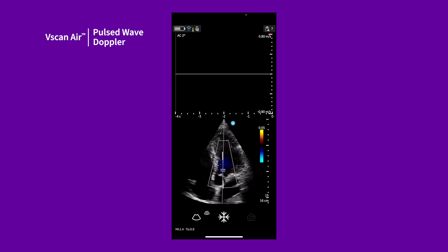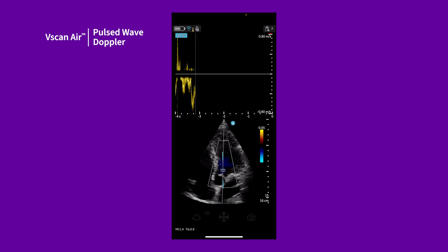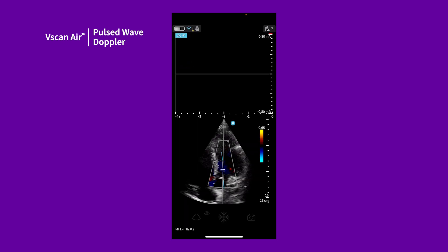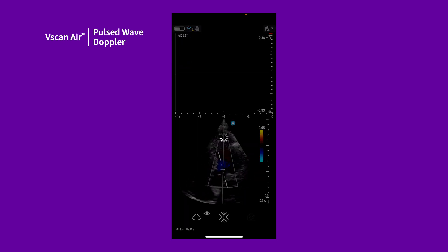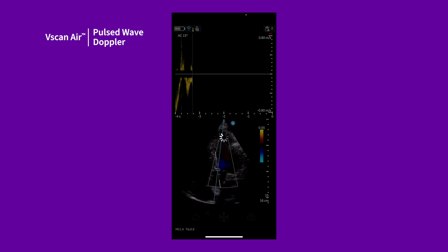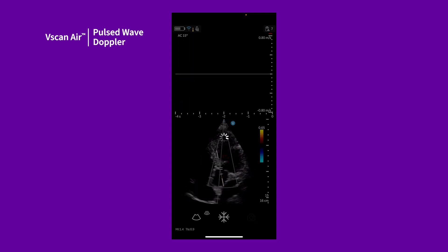You can further adjust the position of the PW cursor at the same gate by dragging it with your finger. You can also adjust the angle correction by dragging one end of the angle correction line up or down.